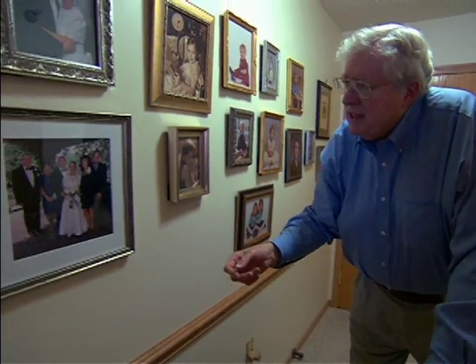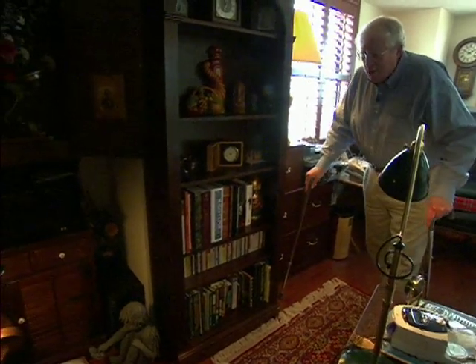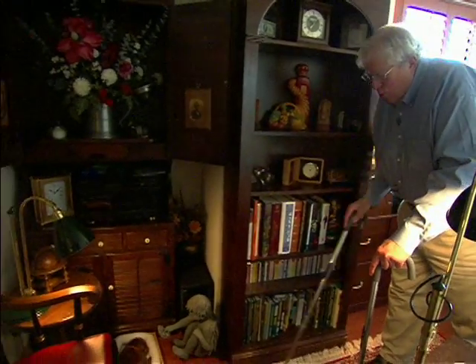It's working for John. Today, the wound is down to about the size of an egg. And John's able to walk through life knowing his leg is healing. Dr. Andrews says the Circulator boot may not be right for everyone. People with blood clots in their legs or people with certain levels of heart failure should not use it. But for many people, the Circulator boot may help avoid an amputation.